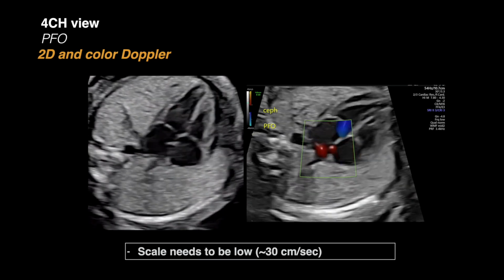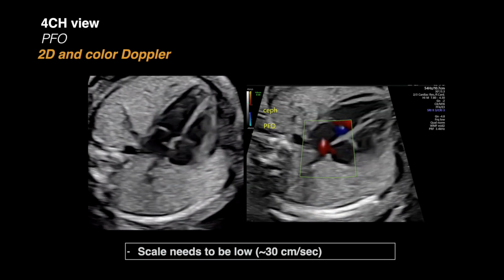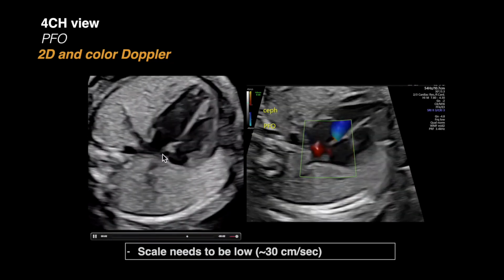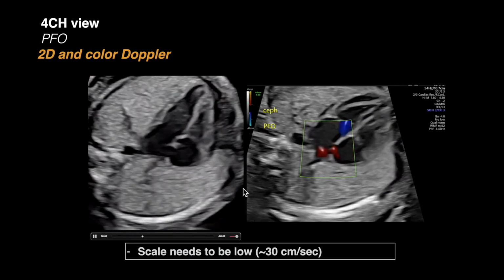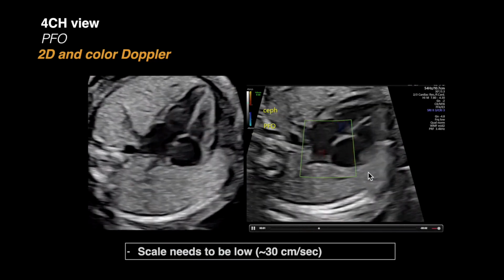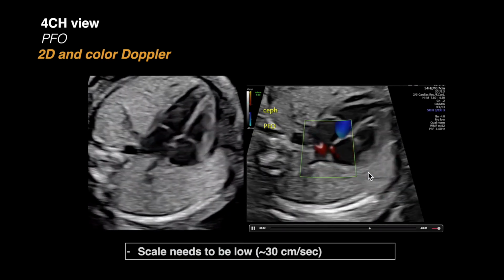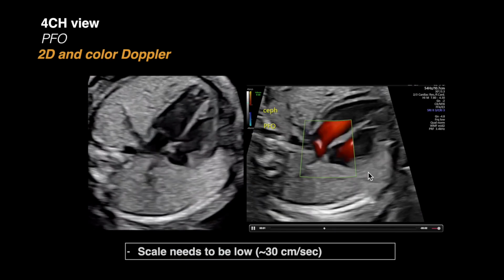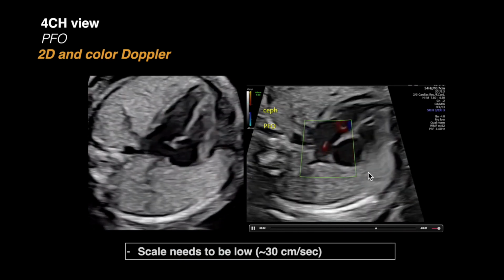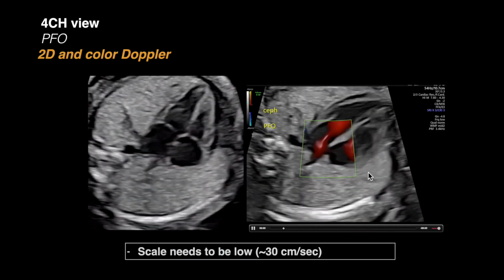And do need to scan at a little bit of an angle, so this is not ideal for an apical insonation, but here I'm coming in at about 45 degrees. I can see in 2D my foramen ovale flap coming over towards the left and then confirming with color. So important with the color for the foramen ovale, in my experience, to really optimize. So you want to have your color box small and color scale low to see that flow going into the left atrium.